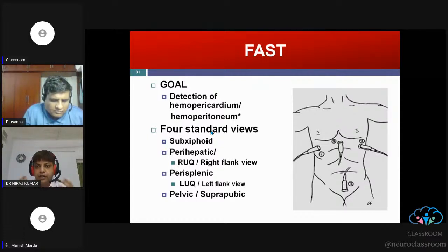But what about an internal source of hemorrhage? You cannot see the internal source of hemorrhage. So how do you manage? If the patient is not responding, you have to suspect that the patient might be bleeding inside. There is a dictum that when you are seeing blood on the floor, you have to see four more. The four common sites for internal bleeding are the chest cavity, the abdominal cavity, the pelvis, and the long bones. Ultrasound is very useful to see the common sources of internal bleeding. That is the first examination you have to quickly perform, to see the accumulation of blood or fluid inside.